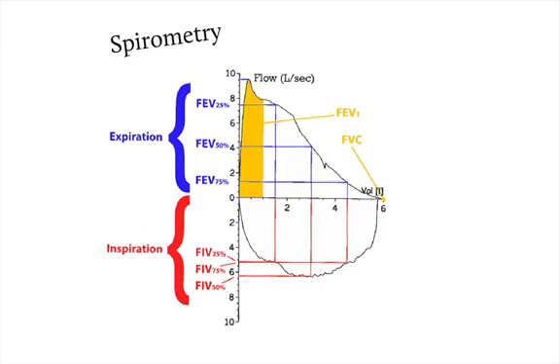So you notice that when someone breathes out, most of the flow happens at the beginning, and then it tails off towards the end. And this is the inspiratory segment. So we've got a negative flow here and a positive flow on the expiratory. You don't see these that often. They are in exams and they are in books, so it's worth knowing about them.